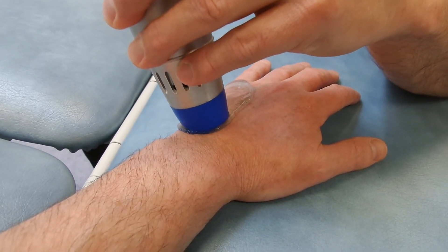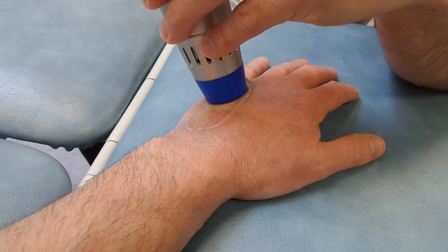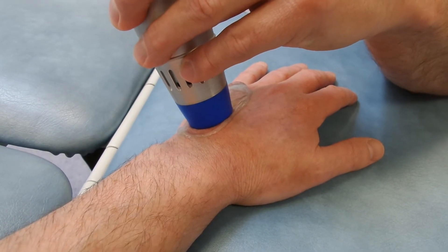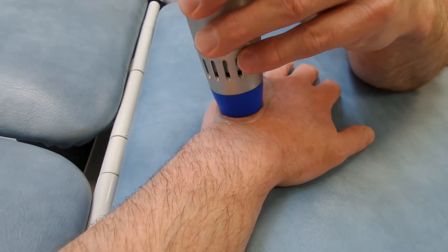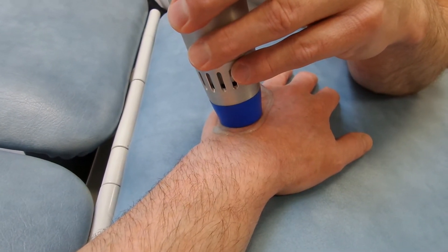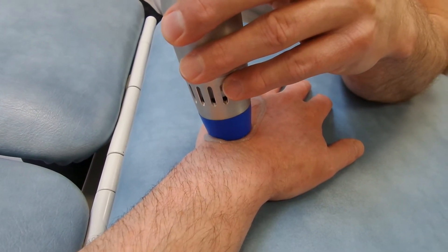Although interestingly, the last week since the last session or so, I've had no symptoms at all in my hand. Oh, that's good news. Yeah, it is interesting on these electromagnetic ones — you can literally hear the changing tone, can't you? You can hear it just there. Yeah, and that there is the residual deep ache that I was experiencing that I've not had last week.